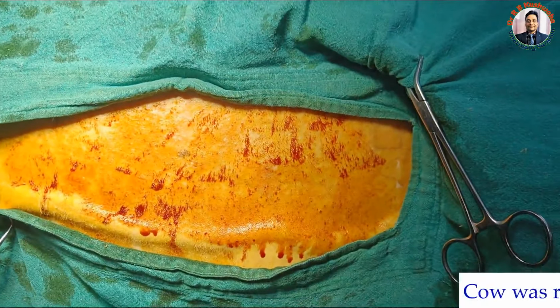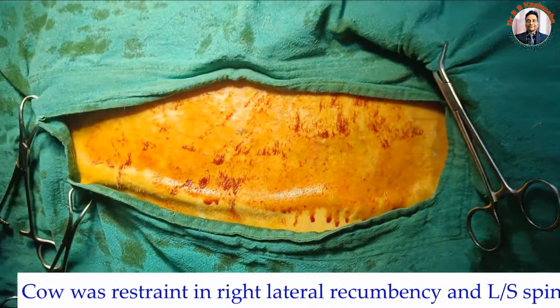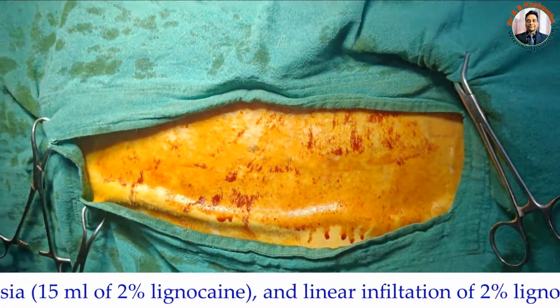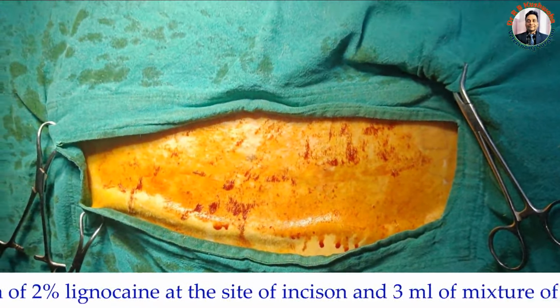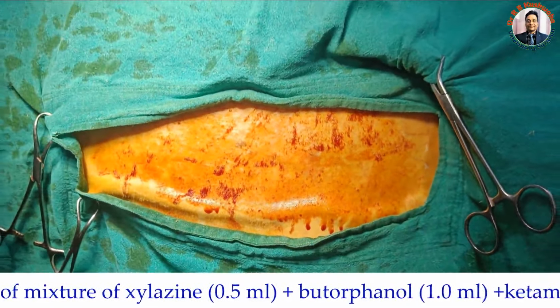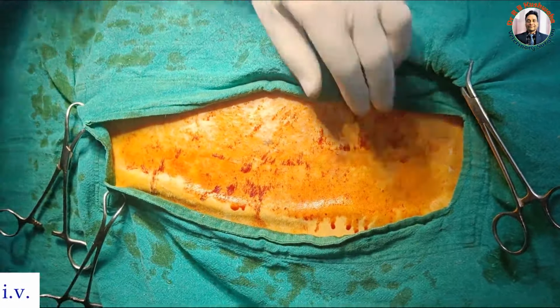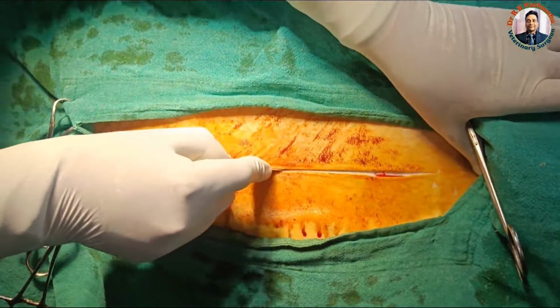As far as anesthesia is concerned, I have given lumbosacral spinal analgesia to desensitize this whole caudal area. At the same time, I have also infiltrated 2% lignocaine solution for local analgesia, and I have injected a mixture of xylazine, butorphanol and ketamine in the ratio of 1:2:3, a total of 3 ml intravenously. This animal strained a lot, and this is the reason we have given the lumbosacral spinal analgesia. The length of the incision should be 30 cm long.